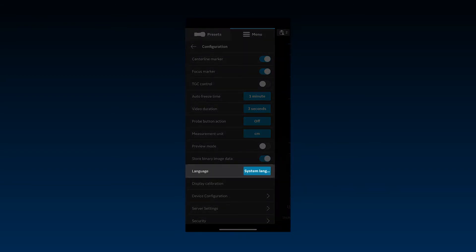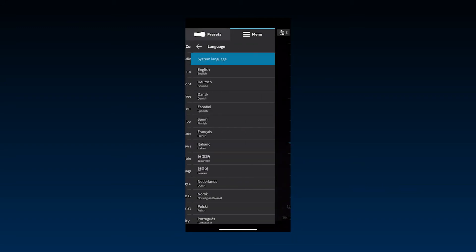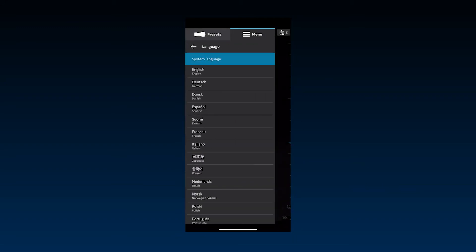Language is defaulted to your mobile device language. To change the language, select Language and then select a specific language.